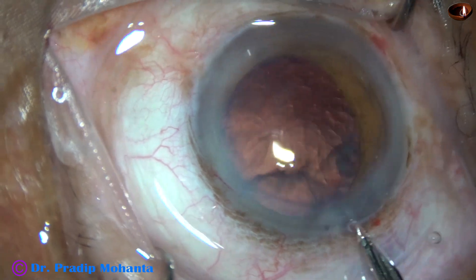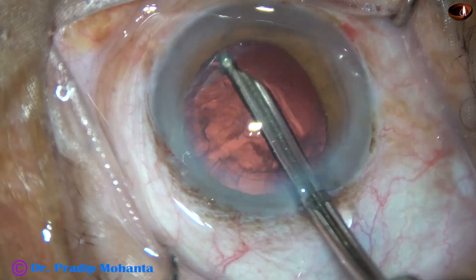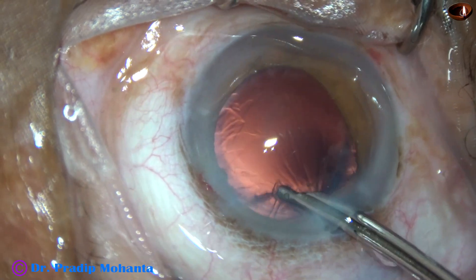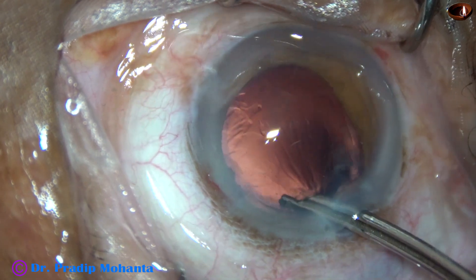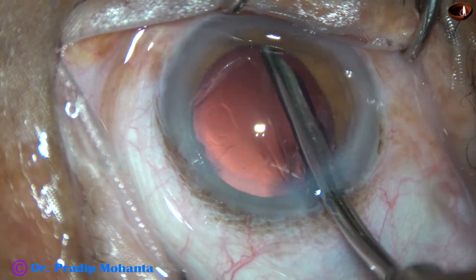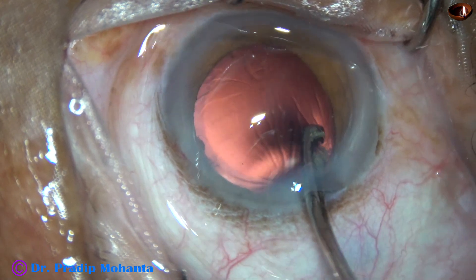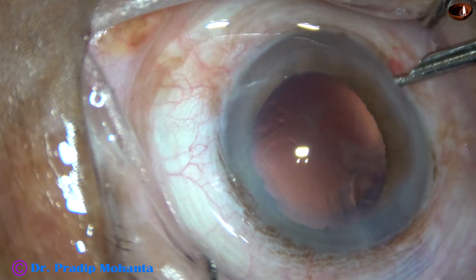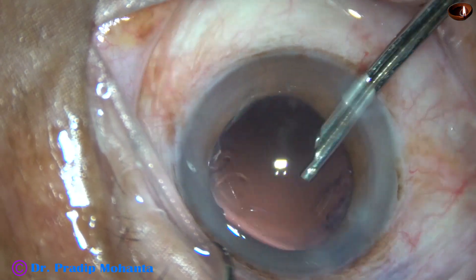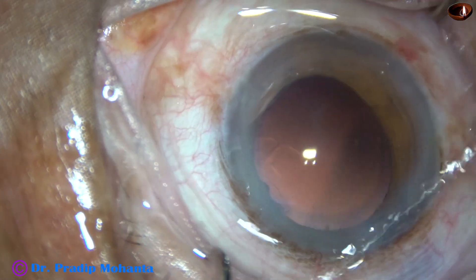The machine that has been used is the Oertli Cataracts 3 from Switzerland. This is a beautiful machine — you can carry it anywhere you go, and you can do such hard cataracts with it. See the main wound: there is no wound burn. So this machine is very good, and particularly the clever design of the phaco needle is just awesome.